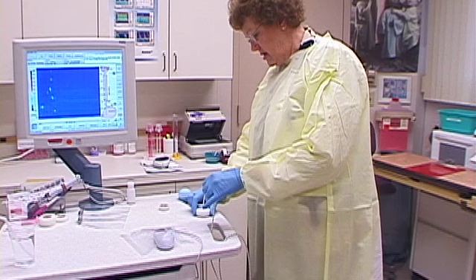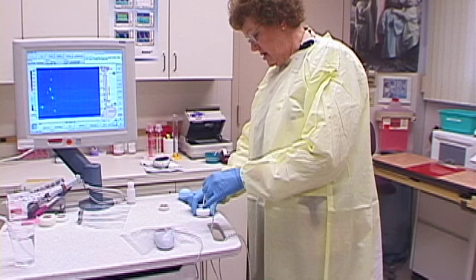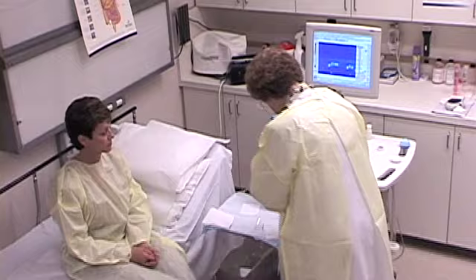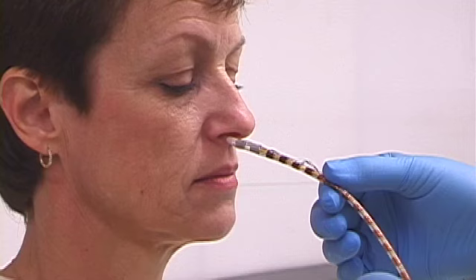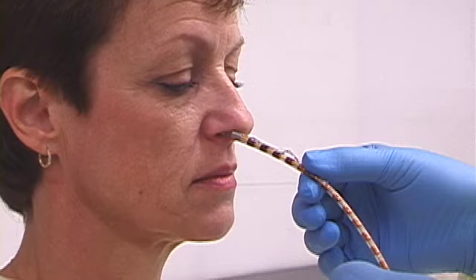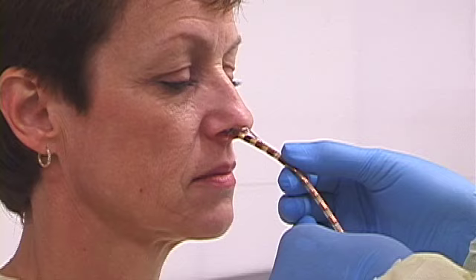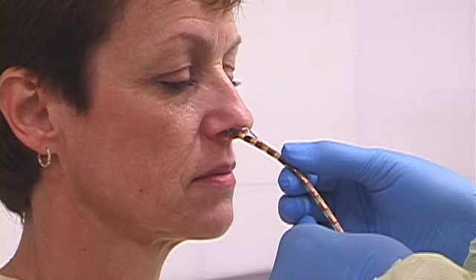Once the anesthetic has taken effect, a catheter is prepared. The thin tube has sensors at various locations which measure pressure as the esophagus squeezes the tube. The information from these sensors is transferred to a computer that shows the information on a moving display. The patient is seated in an upright position with the chin down, and the pressure-sensitive tube is passed through the nose, along the back of the throat.